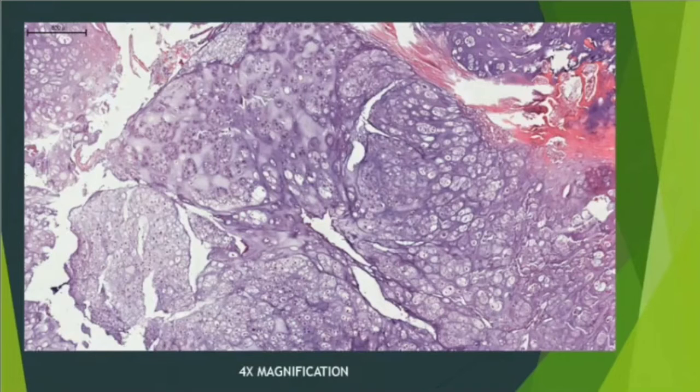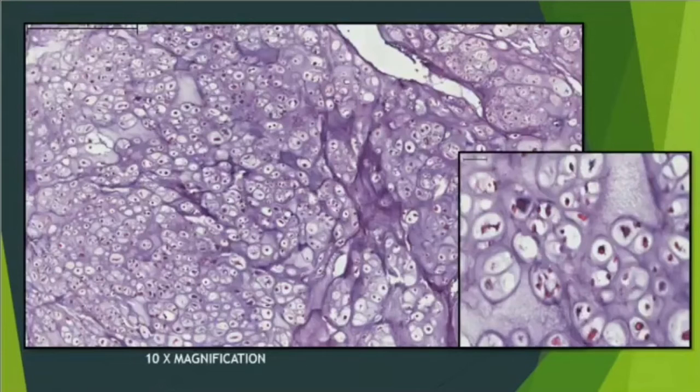The cartilage has varied appearance. The topmost part showing dense hyaline matrix with clumped atypical chondrocytes, and the lower area showing the loose cartilage, the loose matrix with the closely packed large chondrocytes. This is another area of the cartilage cap, where we see binucleate and multinucleated chondrocytes.